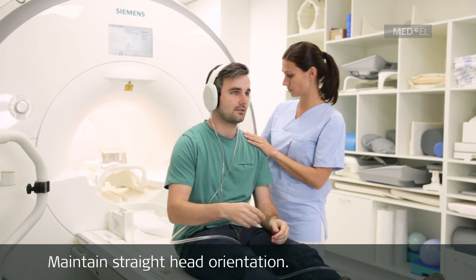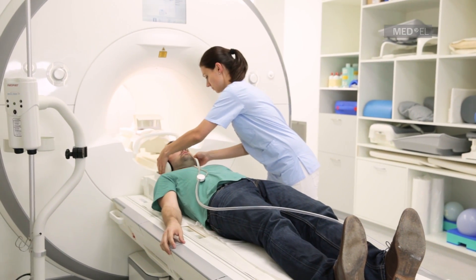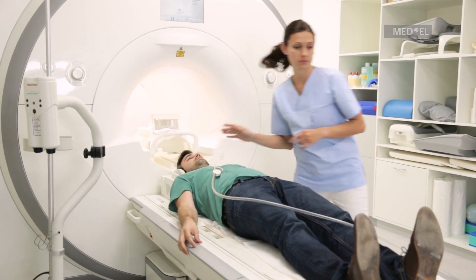Have the patient maintain a straight head orientation. An image artifact will be present in the implant area during MRI head scans.